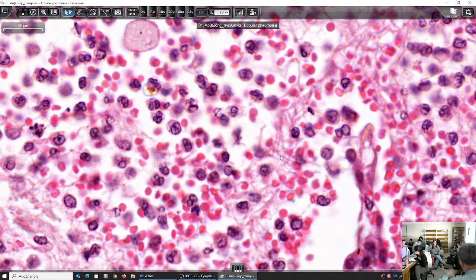There's a question there. Yes, please. If we have an increased number of neutrophils, we might call that a microabscess. However, this is in a pre-existing cavity. The abscess forms a cavity on its own. It's not an accumulation of neutrophils in something that pre-existed. But you would say that such an inflammation would be suppurative inflammation, because the collection of neutrophils is called pus.